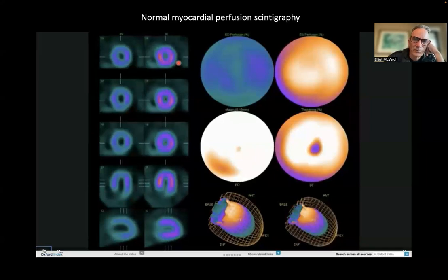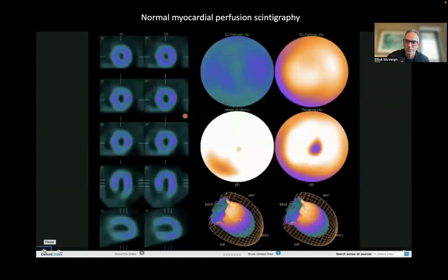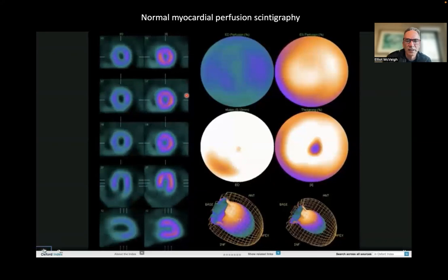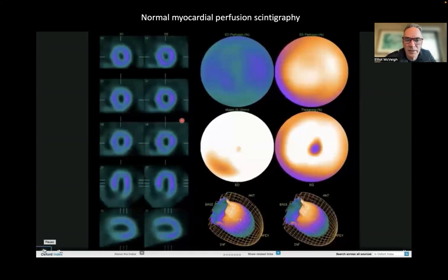You can see the change in activity, and you can also get a relatively low spatial resolution image of myocardial function. Not great though. This is used to generate a relative ejection fraction of myocardial function, but I wouldn't recommend doing high resolution wall motion abnormalities with this type of imaging. However, it comes for free, right?